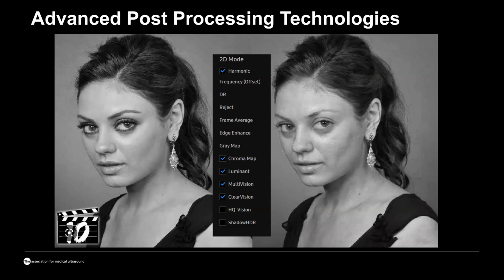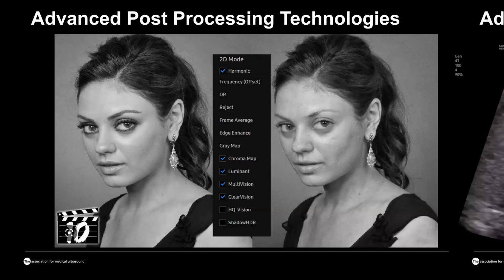This is in particular important when we are talking about patients with very difficult scanning conditions, and you probably know how hard it is to do the sophisticated assessment of the heart when the patient has a higher BMI, has had prior surgeries on the abdominal wall, and other issues.